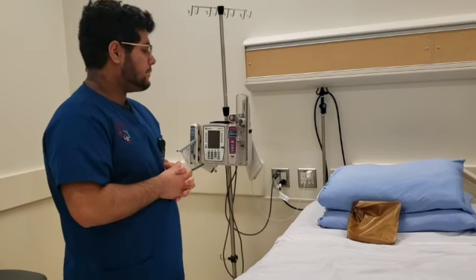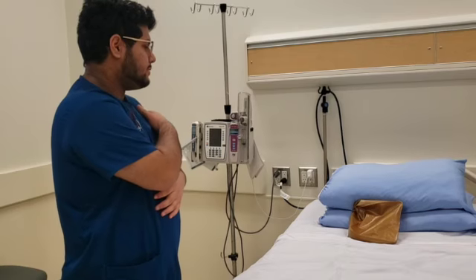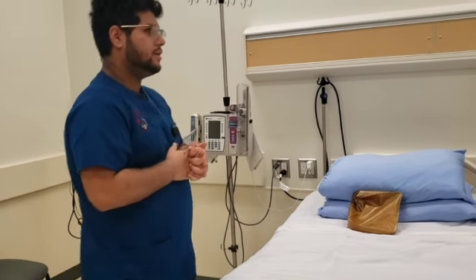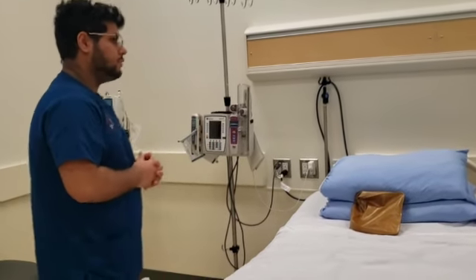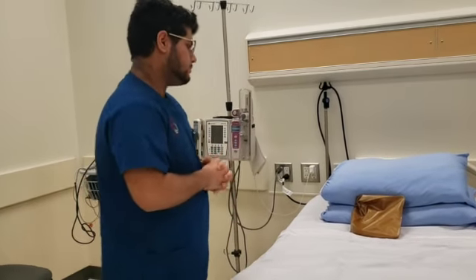Heparin is more of a subcutaneous injection, and that will be given at the abdomen, thigh, lower back, or upper arm. We'll just give it in the abdomen area just because, again, access is easier and that seems to be the most appropriate site.